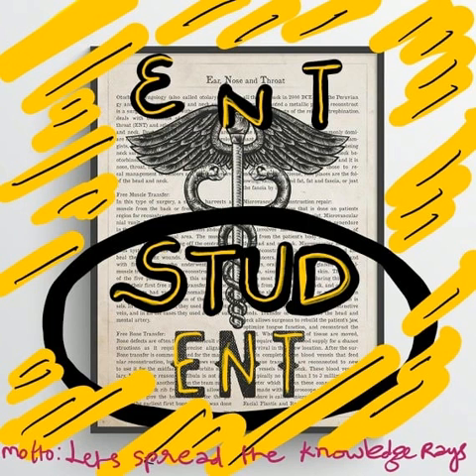This is done to provide maximum visualization before entering the antrum. Thus, a kidney-shaped mastoid cavity is obtained. Structures like the tegmen plate and sigmoid sinus are identified by change of color in the bone. Sigmoid sinus is bluish and tegmen plate is pinkish, and by the presence of bleeding in live surgery.